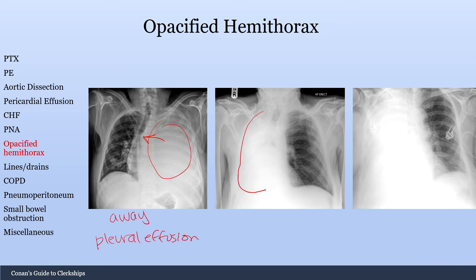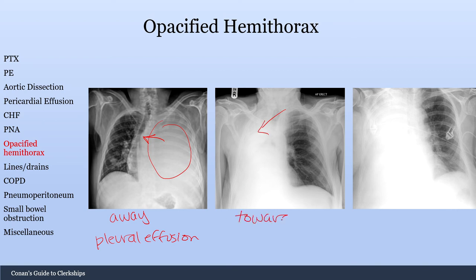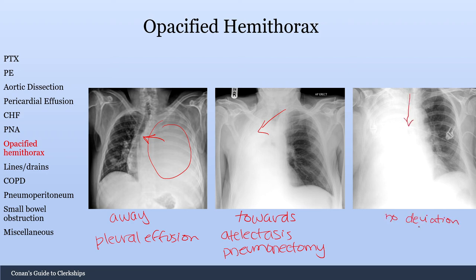In this case you have the opacified hemithorax with tracheal deviation towards that side — the differential is atelectasis, which is collapse of the lung, or pneumonectomy, the surgical removal of that lung. Because of that there's an empty space causing tracheal deviation toward that side. With no tracheal deviation, the differential would be a massive pneumonia or something causing white-out without pushing the trachea to either side.